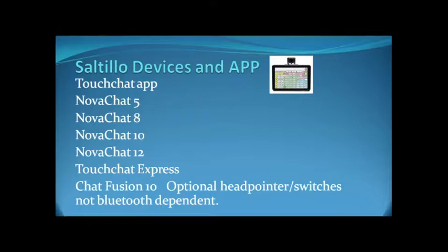The Touch Chat Express is actually an iPad device that can go through funding. But if your funding determines a device has to be locked from the internet, Touch Chat Express, any iPad device, is not really very useful when it's locked from the internet, because the iPad doesn't let you get into anything else, not even the camera. Your updates are harder, everything. So if you need a dedicated device, the NovaChats as a dedicated device allow you to go to the camera and to other things. So please go that route. They're pretty much the same on the inside, or just get an iPad with the app on it.